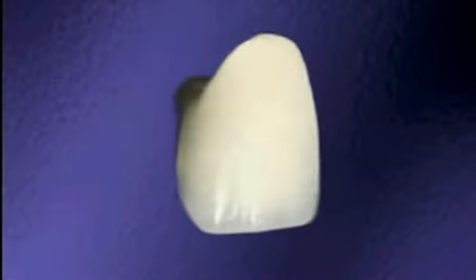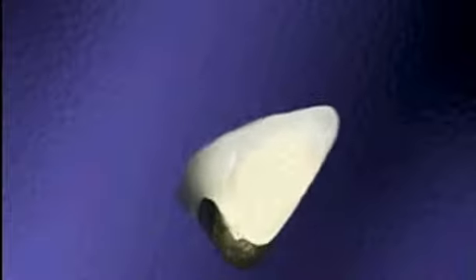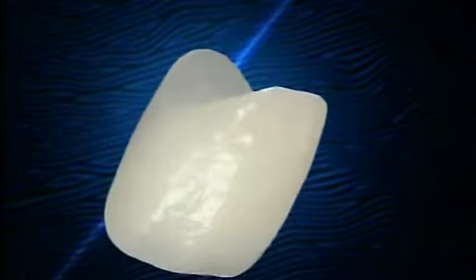If you're having a tooth-colored crown made, it could be a porcelain metal crown. Or with new technology available today, it could be an all-porcelain crown.